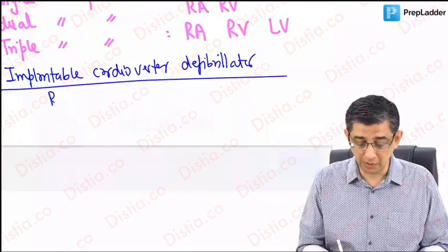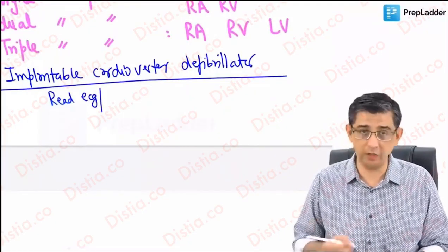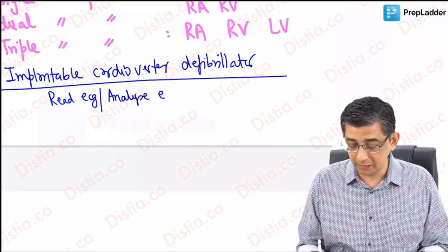But first, I want to teach you that ICD as a device will do what? It will read ECG better than any of us, because this is a sophisticated computerized algorithm. It will analyze ECG.